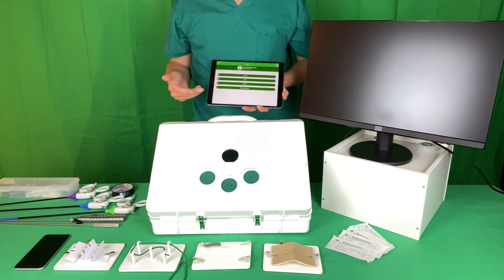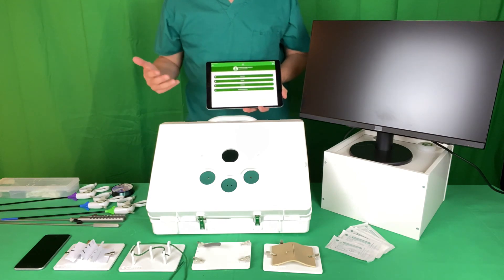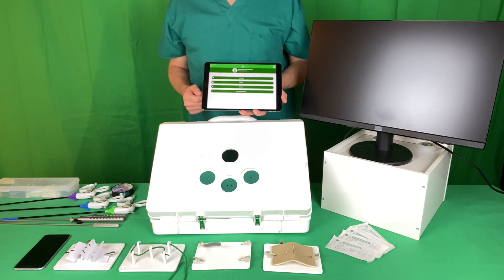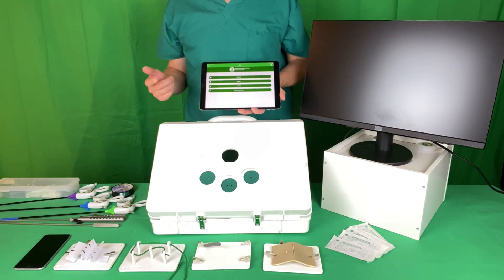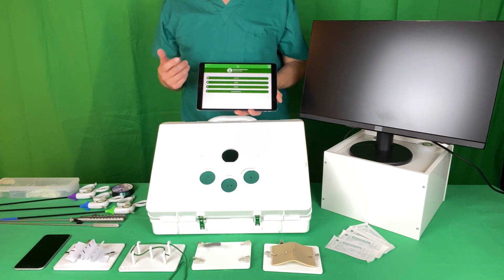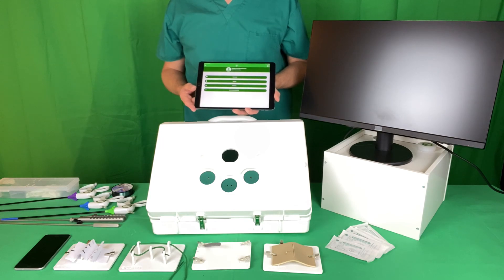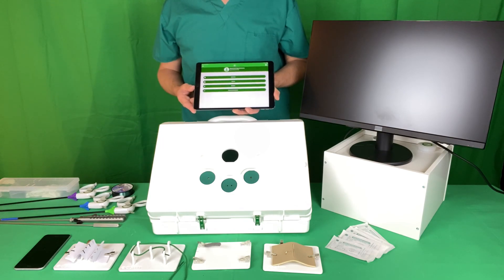SurgeTrac is an application that provides a curriculum of skills including training videos to demonstrate how you should be practicing. It maps the movement of your instruments inside the box so you get objective performance feedback, and then it collates this into an online portfolio with which you can demonstrate skills progression.